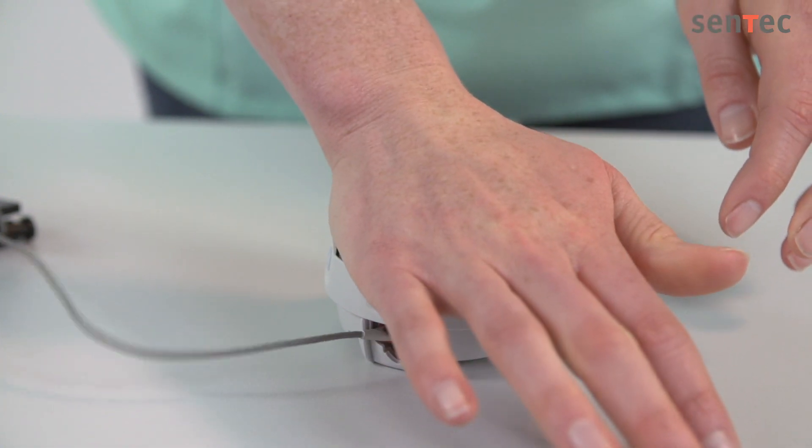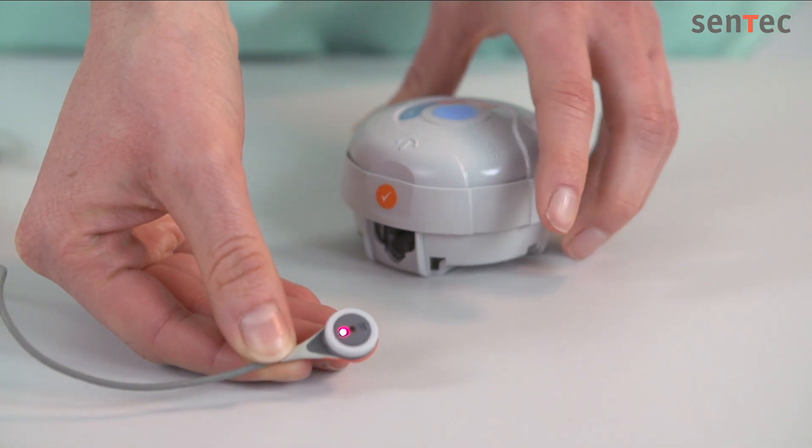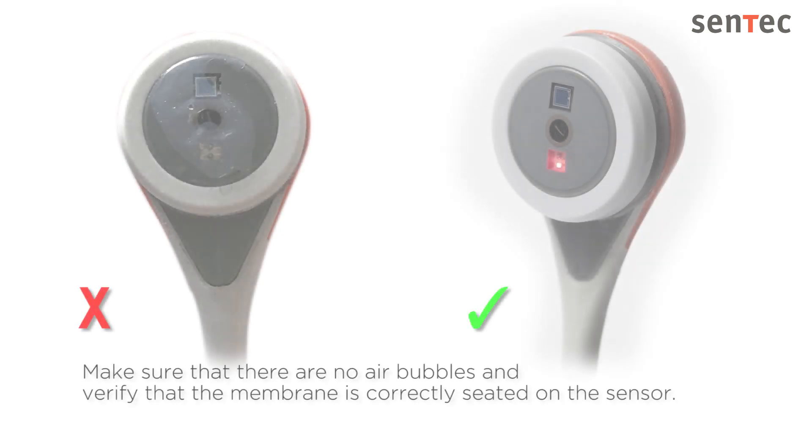Press slightly or directly lift the sensor to remove it from the membrane changer. Make sure that there are no air bubbles and verify that the membrane is correctly seated on the sensor.